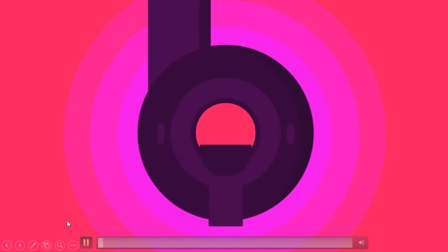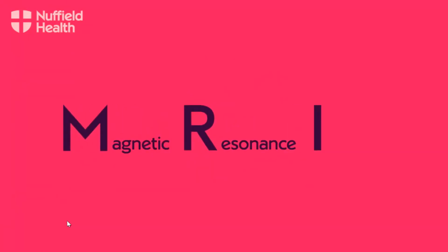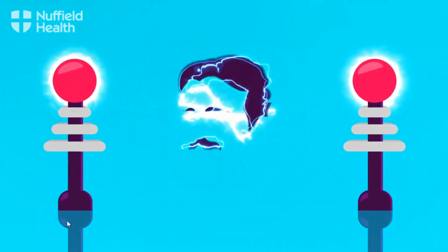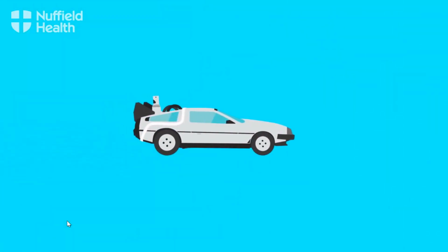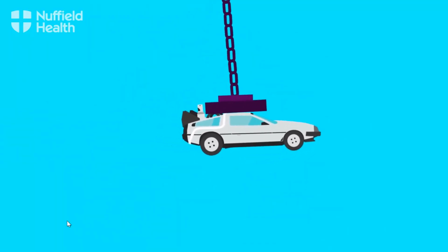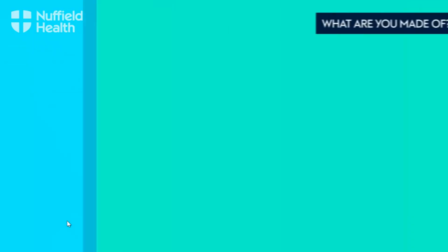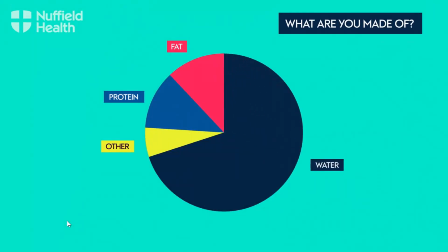An MRI scan looks deep inside your body to produce detailed images. But how does it work? MRI, or magnetic resonance imaging, uses magnets, really strong ones. Magnetic fields are measured in Teslas, and a typical MRI scanner produces 1.5 Teslas, more than enough to pick up your average car. But it also has an interesting effect on the particles in your body. The human body is made up of all sorts of things, including fat, protein, and other stuff like minerals. But most of it, around 70%, is water.